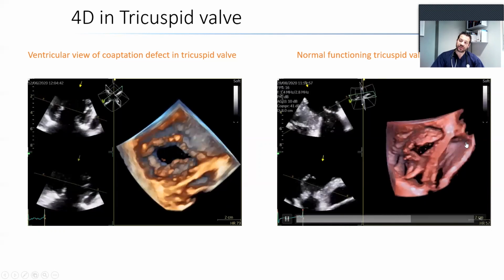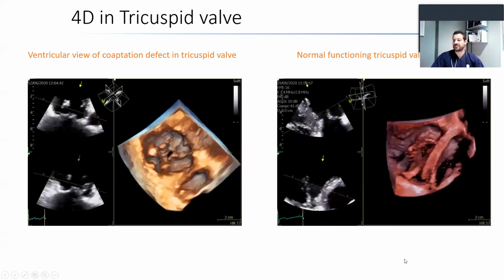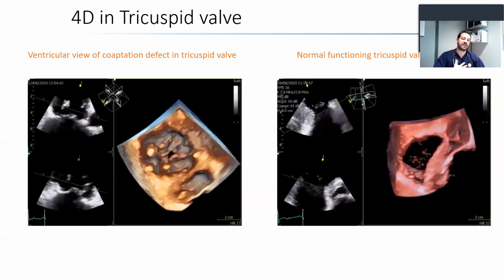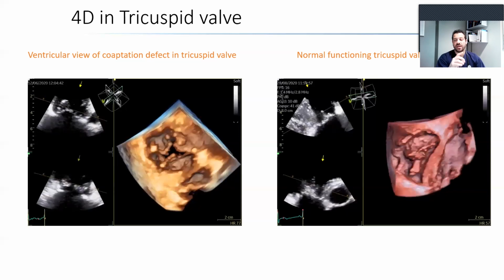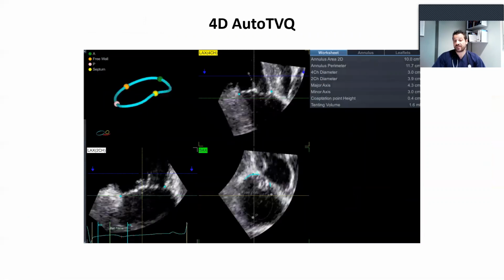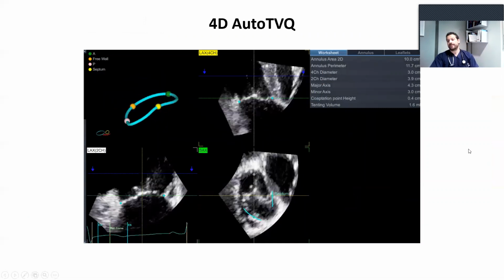On top you can see the aortic valve. So opposite to the aortic valve we have a small posterior leaflet, and next to the aortic valve we have a large anterior leaflet. Always remember that as right cavities and the tricuspid valve are just behind the sternum, it is better to obtain our images for the tricuspid valve from transthoracic echo and not from transesophageal echocardiography. We can also have information about the tricuspid annulus, and this is very important for interventionists and cardiac surgeons where we want to implant an annulus ring.